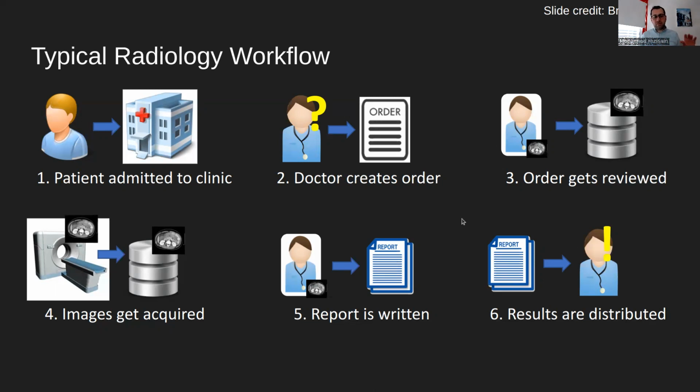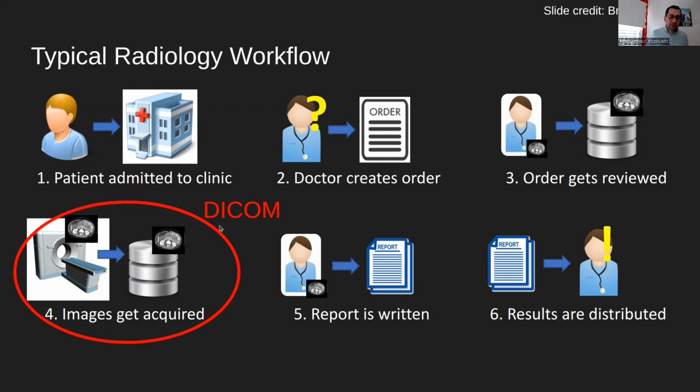Now, at a very loose high level, not all of these steps are actually DICOM. In fact, really, mainly, it's the one particular step of capturing these images that is DICOM based. And of course, then the radiologist, when they read them, they're actually consuming DICOM. Everything else is actually handled outside of DICOM. Now, this is to say that DICOM is a small part of the flow, but an integral part of the flow, because without DICOM and imaging, the vast majority of healthcare wouldn't work.